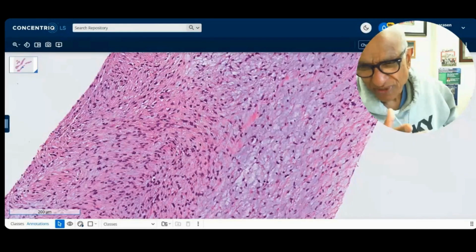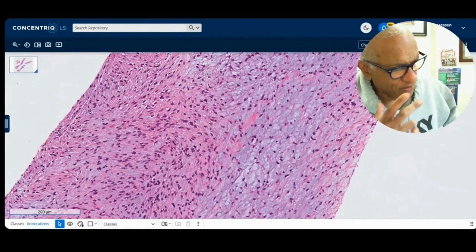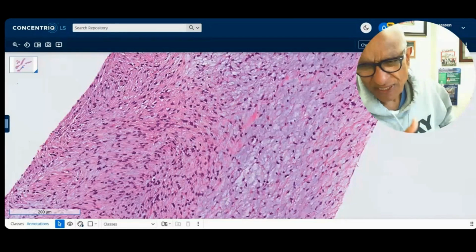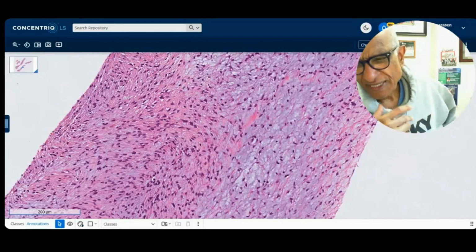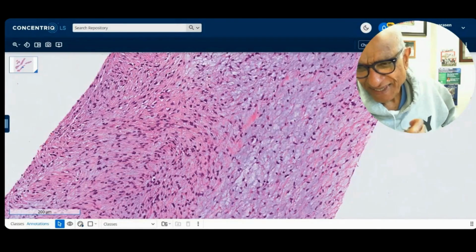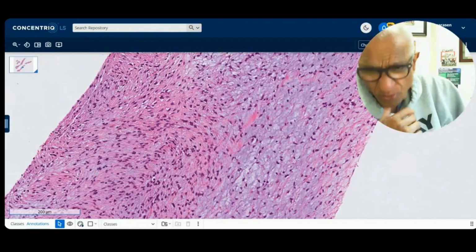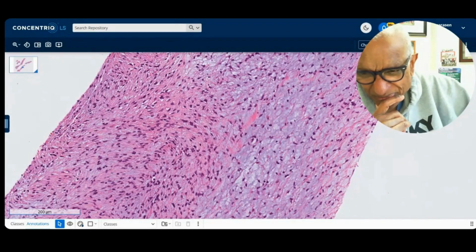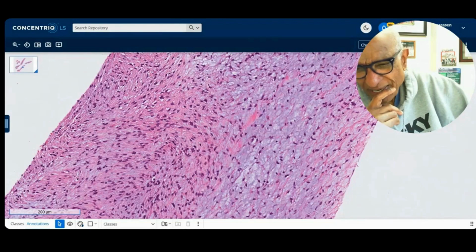So to answer Albert Toole's question after that long story, it wasn't too long, about 40% have them. You'll only see it in resection specimens. You're not going to see it in a biopsy, but you can look for it. Now, did I ever use that as a diagnosis? Yes. In the 90s and early 2000s, I used to look for that because that helped me make this diagnosis with some degree of confidence. So collagen rosettes are useful, right? They were large, giant collagen rosettes, not these small rheumatoid or granuloma annulare type. It's 3-4 times that size. So if you keep looking in your resection specimens, you'll see one.